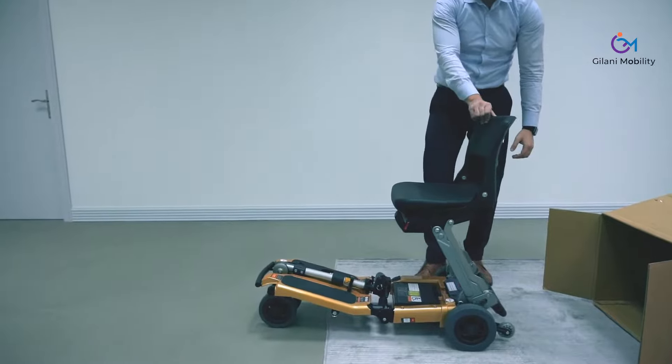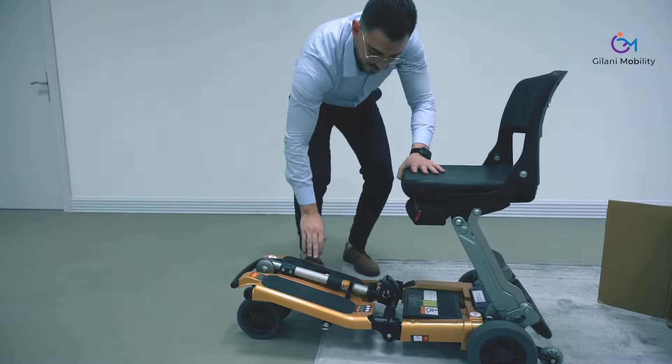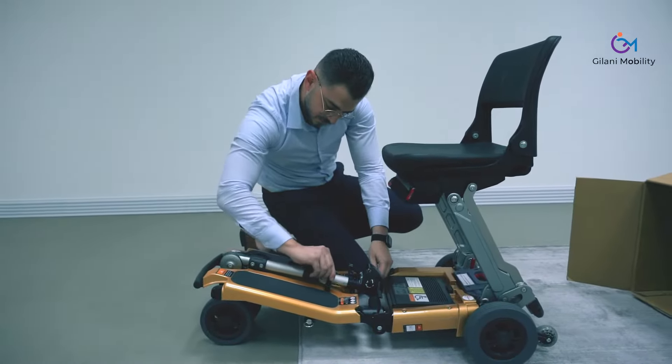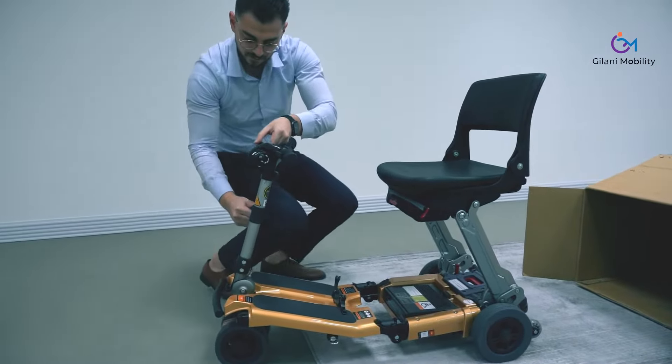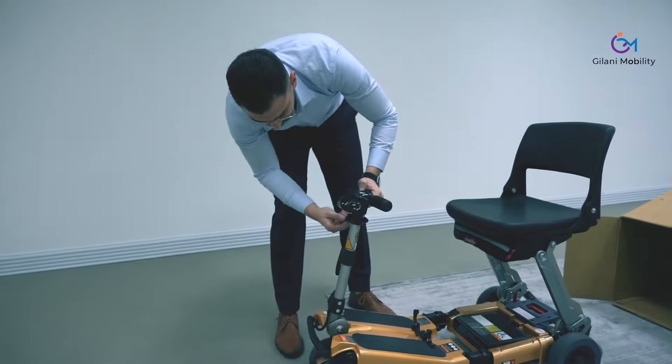The backrest simply folds up, and you can see the armrest handlebar is secured in a very safe location. This scooter has been designed for travelers, so you can hand it over at the airport without any concern about the handlebar or anything getting damaged.